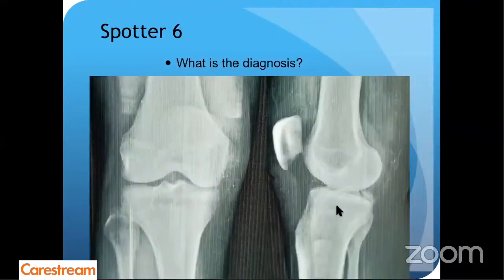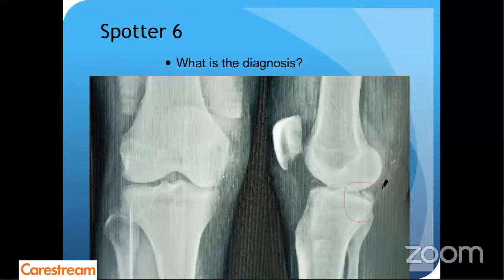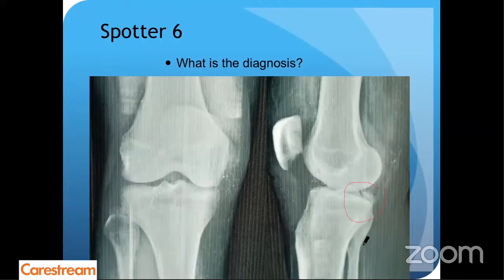Sorry for the X-ray quality — this was the best I could get. What is the diagnosis? So this is a PCL avulsion fracture and it was not displaced. I think everybody got this answer.